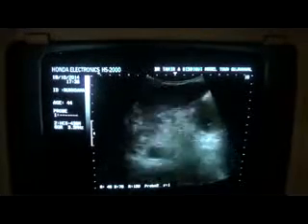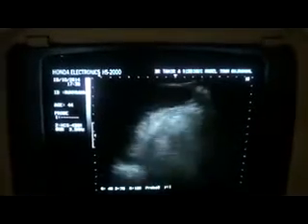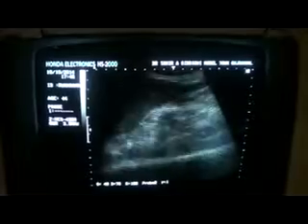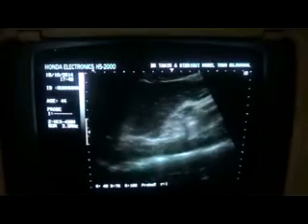So the only finding so far that could be seen in this patient is two enlarged lymph nodes at the paraceliac region. Spleen normal, no pleural fluid, no para-aortic lymph nodes, no ascites seen. Hepatic veins are seen clearly.